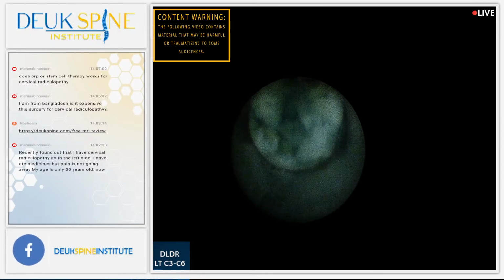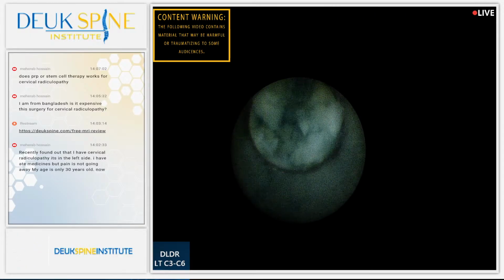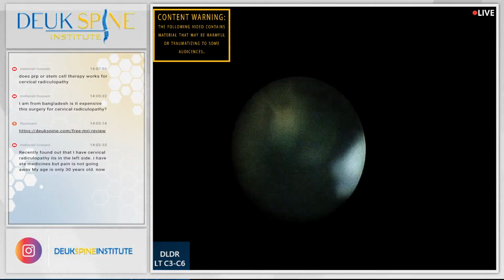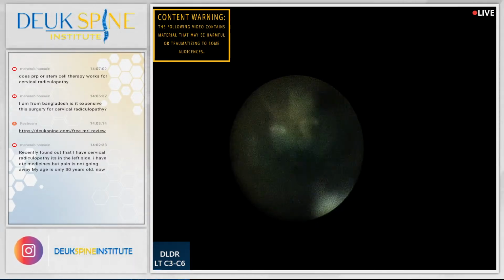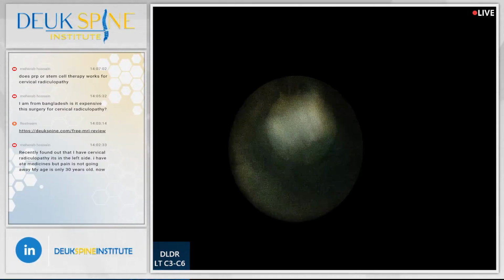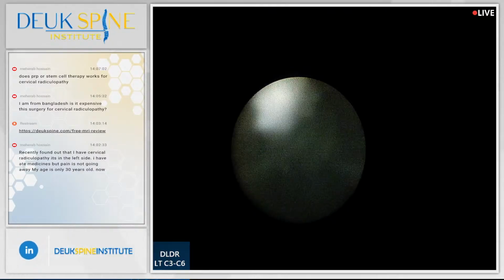Shot? Good. Perfect. All right, we're at the back of the herniation there. You guys see it? And now we're going to start removing the pieces of herniation, using the laser to release them off of the scar tissue. They're scarred down to the annulus.